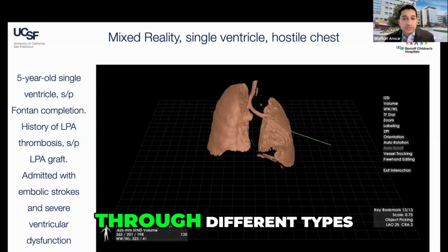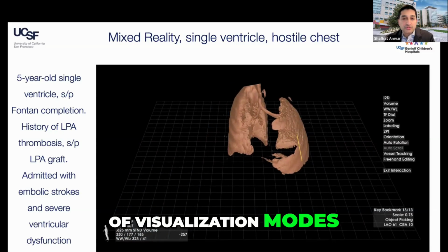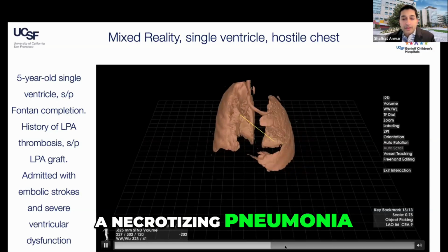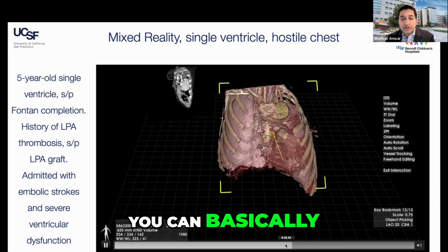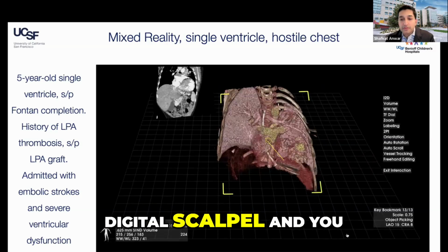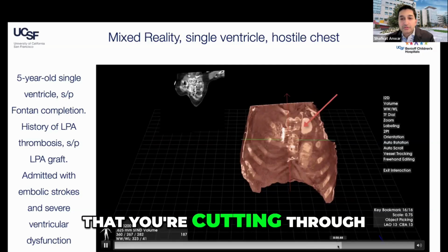You can scroll through different types of visualization modes. So here I'm showing the lungs where the patient has a necrotizing pneumonia. And then you can basically cut through the heart this way as if it's a digital scalpel and you have a cut plane that you're cutting through.